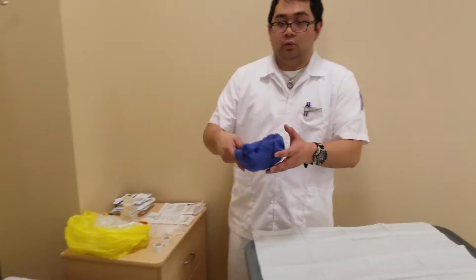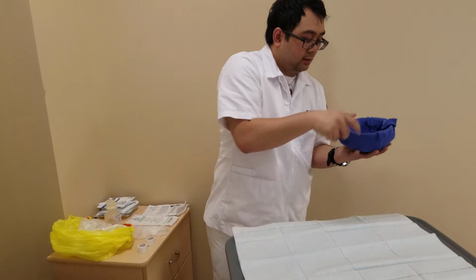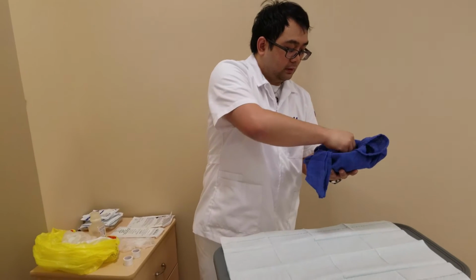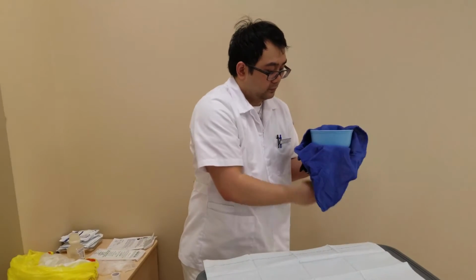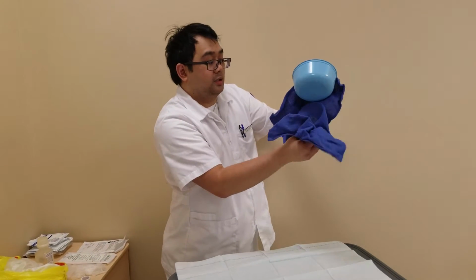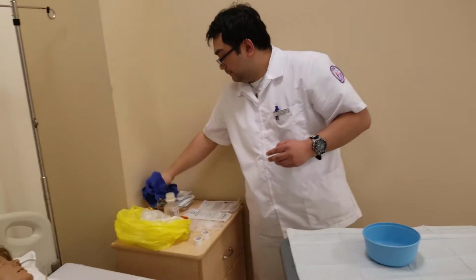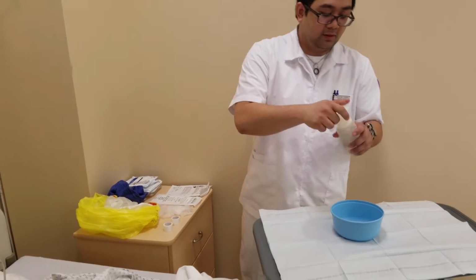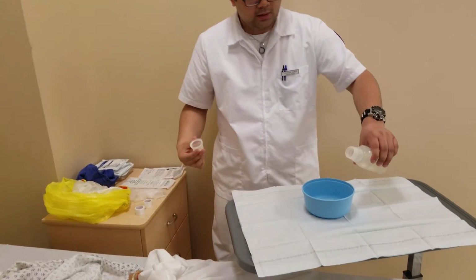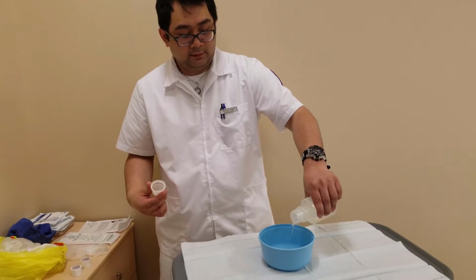Next step, we have a bowl. Just going to quickly undo this. Making sure it's not touching inside of the field. I'm just gonna drop that in. So I'm gonna put some sterile water or some normal saline into the bowl here. I'm gonna make sure that it's not spilling. Seems good enough.